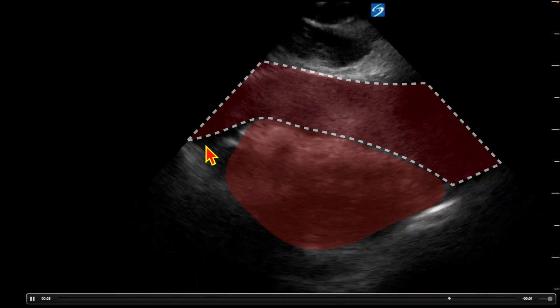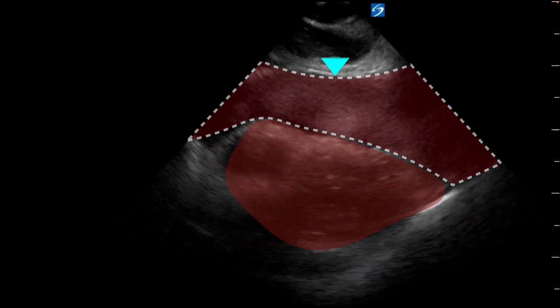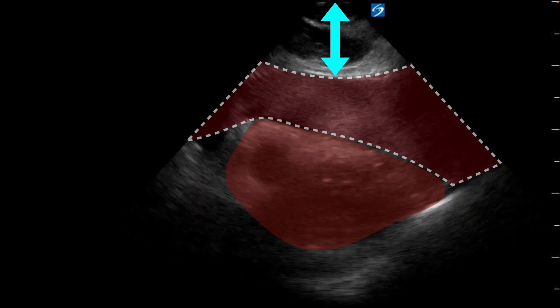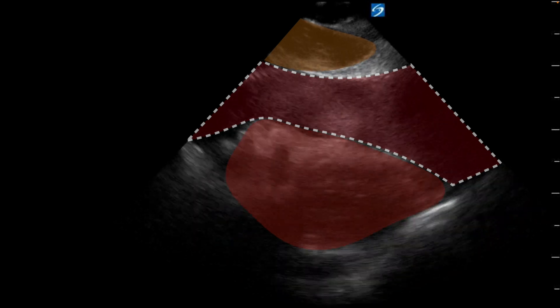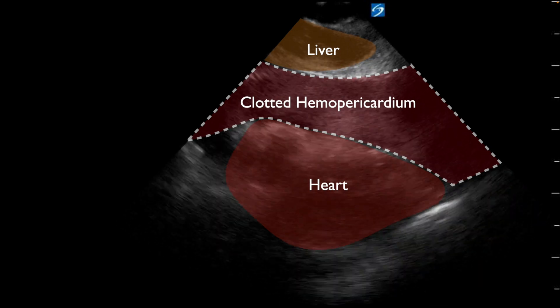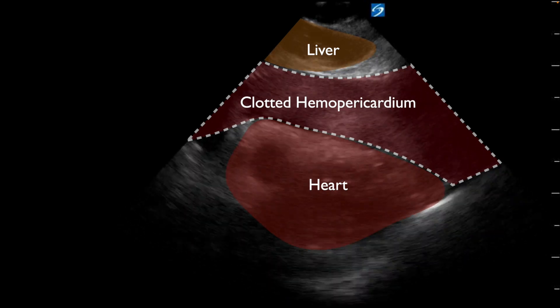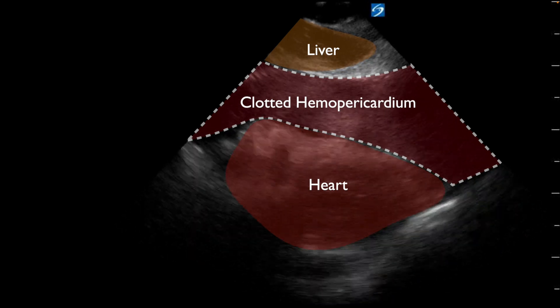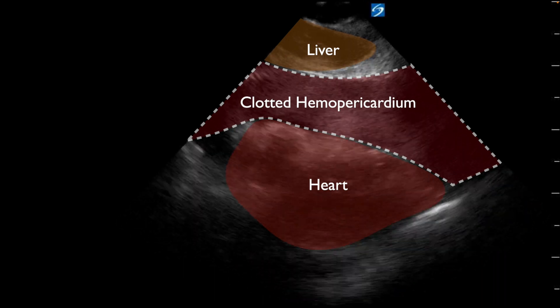We can see the contour comes down near the apex — it's a little different from the liver. In addition, there is quite a bit of space just anterior to that structure, and there's actually a structure inside of it. Working from the bottom of the screen where we can identify the heart and see that motion, we have the heart, and then above that is actually clotted hemopericardium — which can be quite difficult to distinguish from the liver because it is isoechoic. Above that, we have the left lobe of the liver being used as an acoustic window.